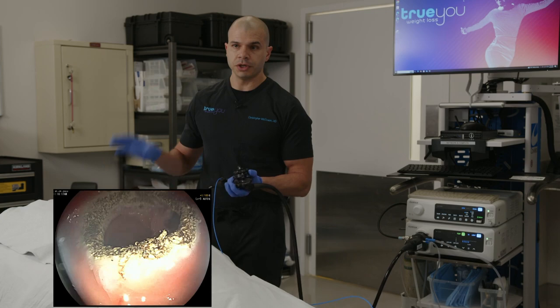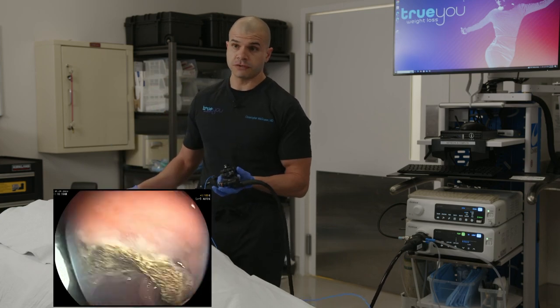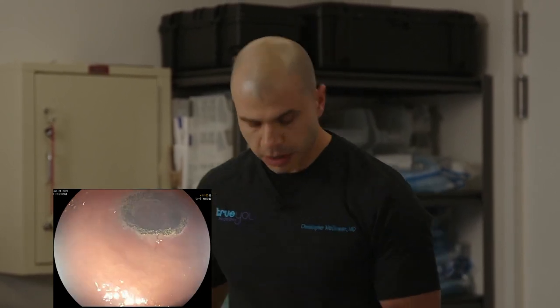The outlet's treated. Now we could pause here and just complete the suturing of this anastomosis, which is the primary focus of this procedure. But I'm actually going to ablate the pouch as well, and I can speak to why that is. But as far as average weight loss, if you look at published studies, if we can change the settings, we're going to change to a pulsed APC at 30 watts.